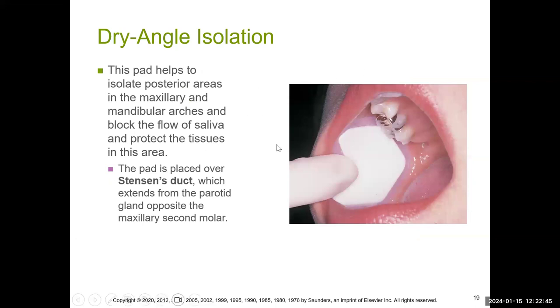You do have cotton roll holders to help stabilize them in place. We also have dry angle isolation — these triangular pieces are really helpful, especially for the maxillary — but dry angle isolation can only be placed on the buccal mucosa.